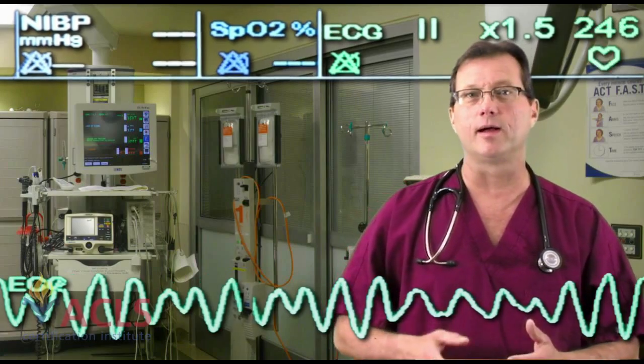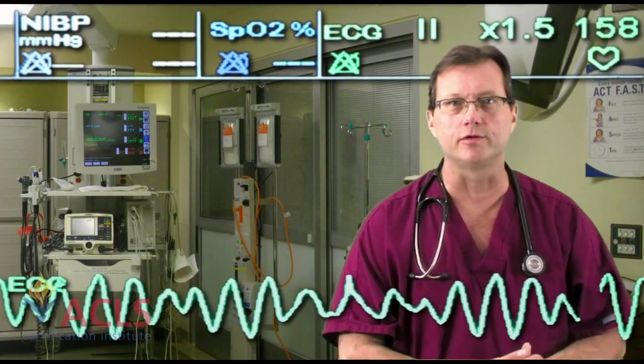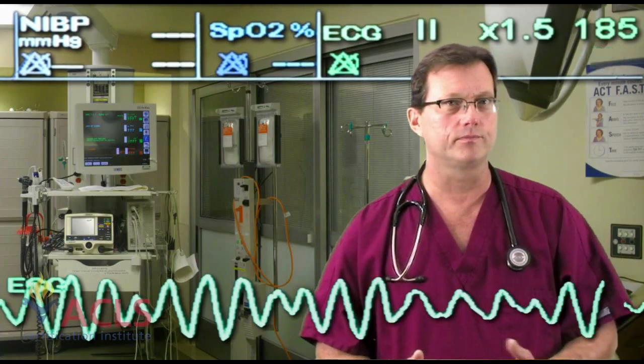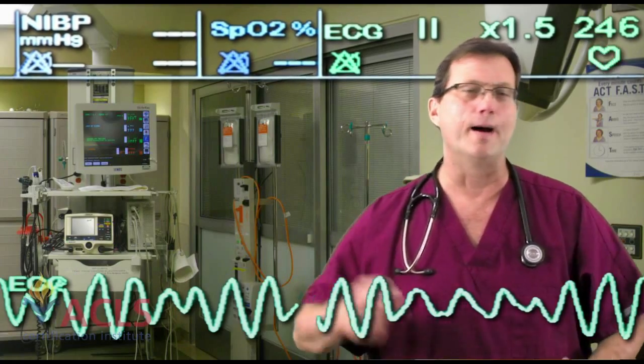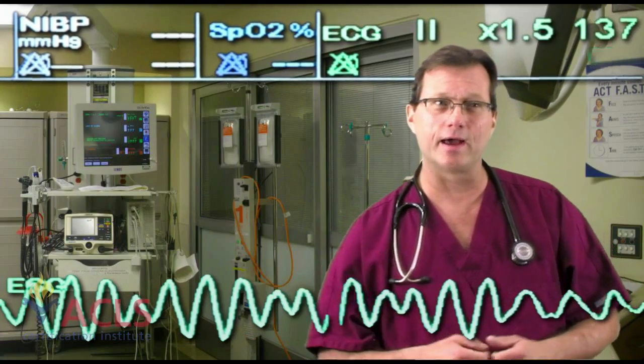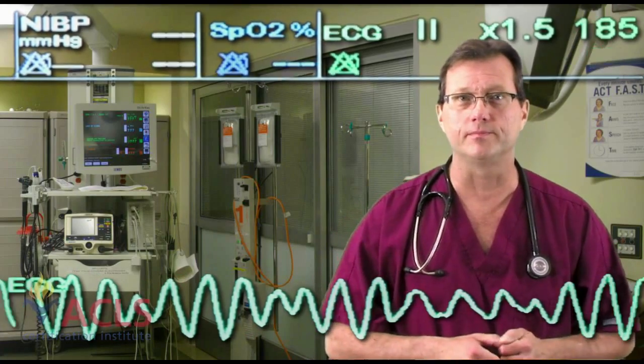We immediately set up for immediate defibrillation. Continue chest compressions until the defibrillator is ready to go. We shock the patient. Immediately resume chest compressions after the defibrillation. Look at the monitor. Patient remains in VFib.